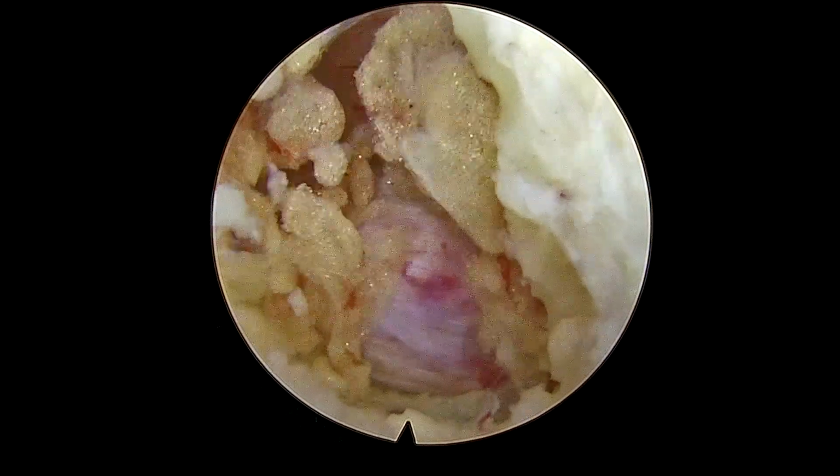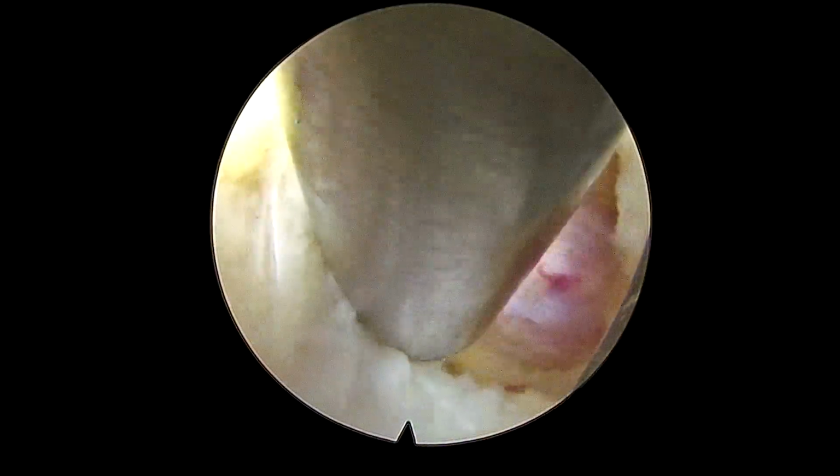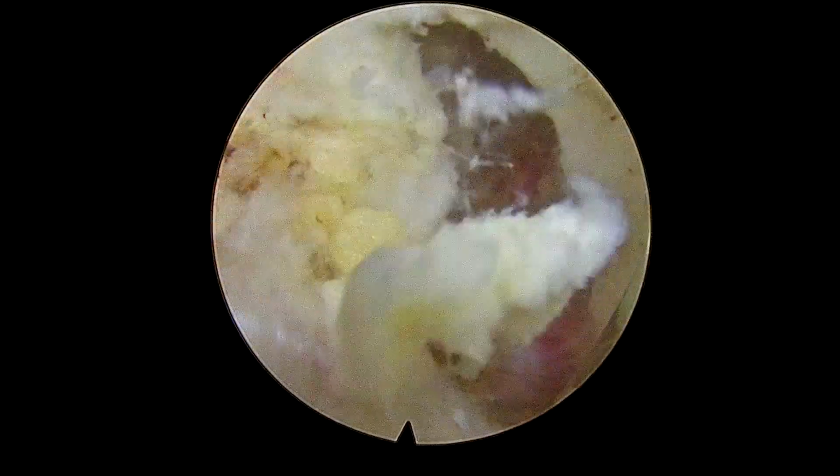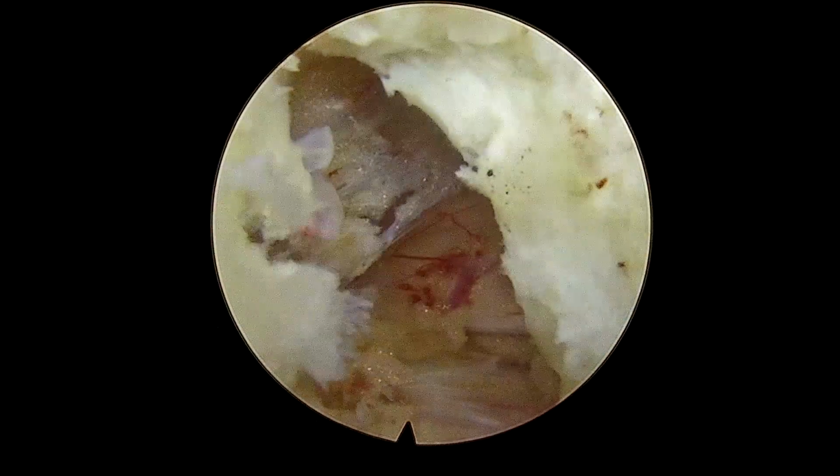So this is a young patient with a very wide interlaminar window. So the reason that you can see here, there is a lot of epidural fat, is because of the wider interlaminar window. So the remaining space other than the neurological structure is occupied by the fat. You can see the fat is creeping from all around.